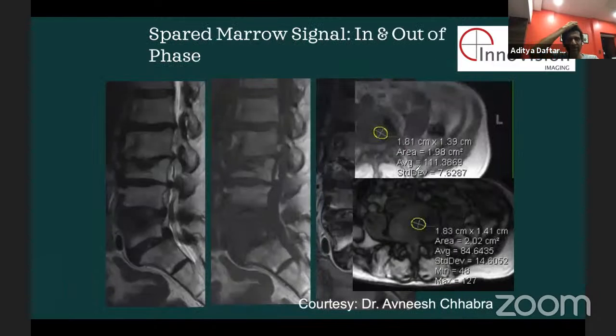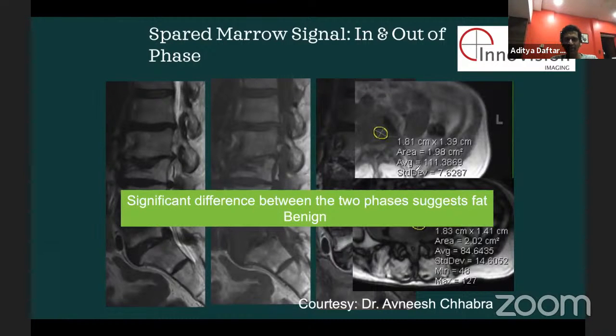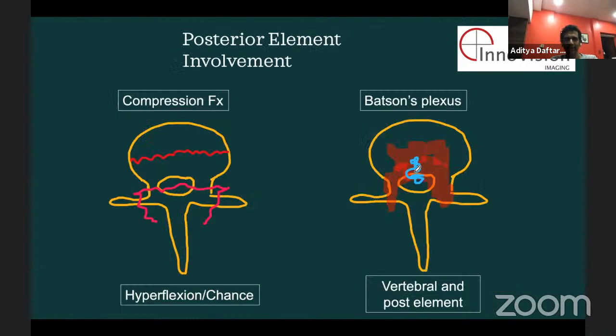Sometimes we can do additional tricks, what we call in and out of phase imaging, that can help us differentiate between these two. We seldom really need this, so I'm not going to go into that.